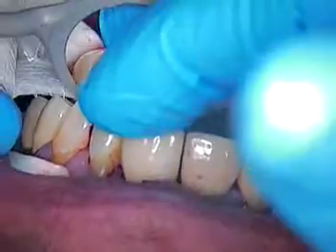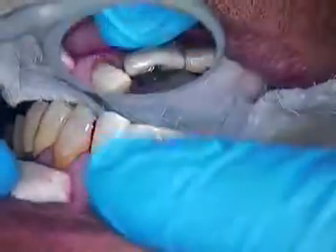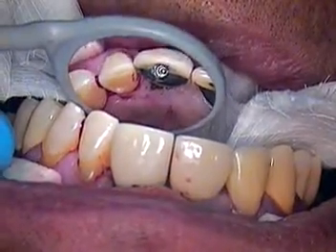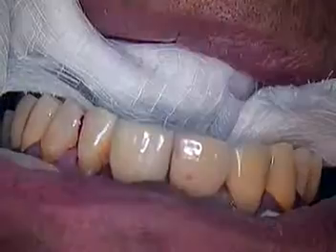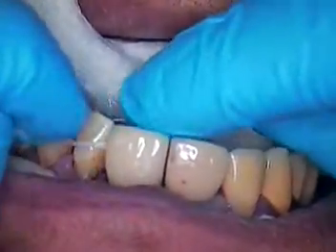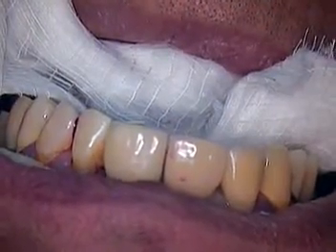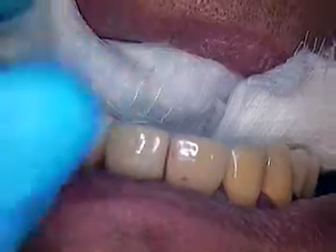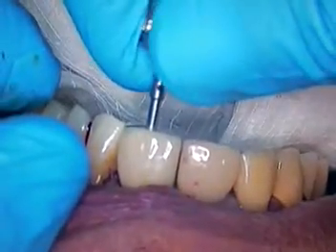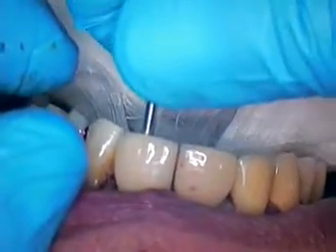I am going to check the distal with some floss. I haven't tightened it down all the way yet, but we're getting there. So need to do that next. So again, thin floss, right. Still good. I might need some finishing strips next, so I'm going to hand tighten it again a little bit. You okay? Uh-huh. Well, that's bottoming out.